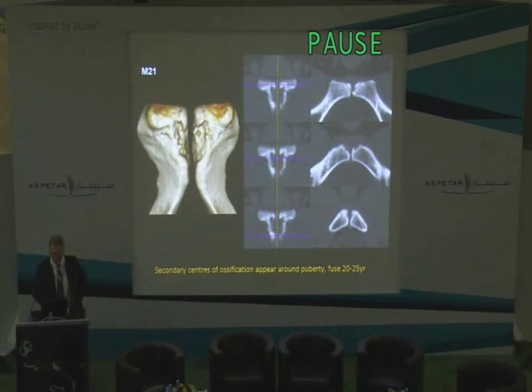But the normal apophysis, you'll see, lies at the anteromedial corner of each pubic bone. It's a unique structure because it actually enters the joint at one end. But the normal apophysis is fairly symmetric in size and has, again, fairly uniform, symmetrically sized physeal plates.